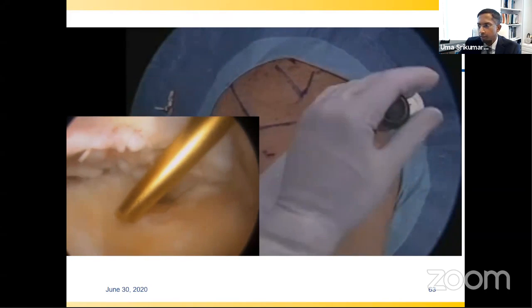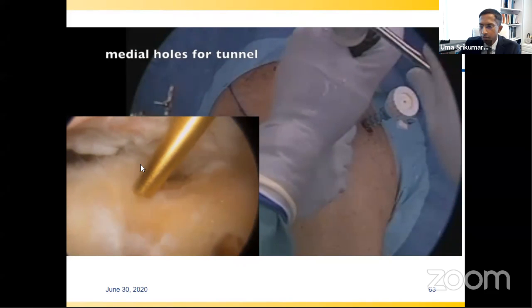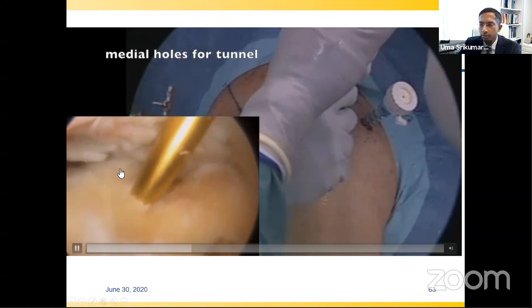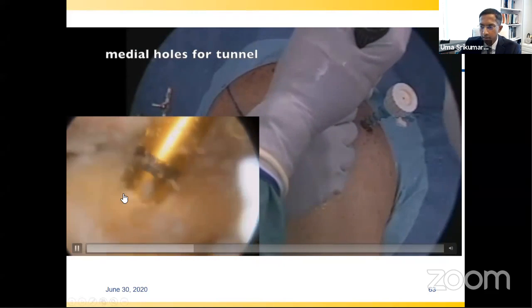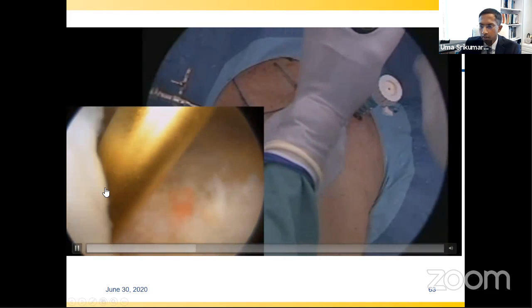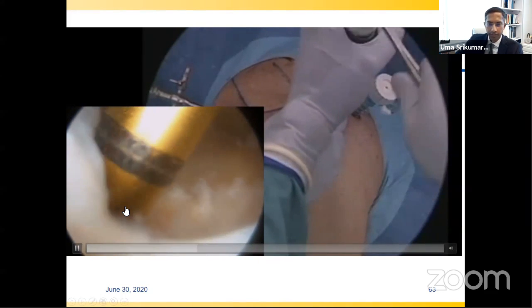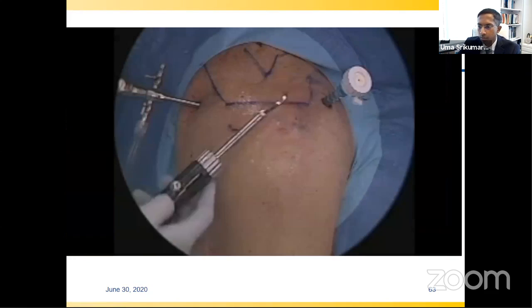This is an awl coming in from laterally. We're impacting it just at the articular margin right here, just as you would for an anchored approach. Instead of placing the anchor, however, after we place this pilot hole, this is the vertical tunnel. So that just created an anterior vertical tunnel. This is a posterior vertical tunnel. You can internally rotate the arm to bring the posterior aspect of the greater tuberosity forward.